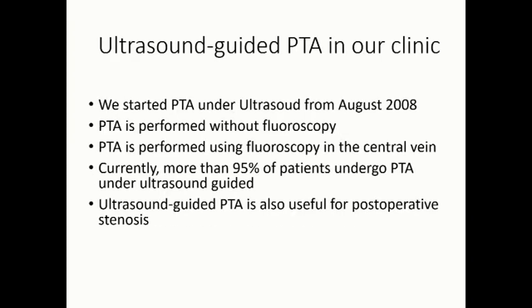Ultrasound-guided PTA in a clinic. We started PTA under ultrasound from August 2008. PTA is performed without fluoroscopy. PTA is performed using fluoroscopy in the central vein. Currently, more than 95% of the patients undergo ultrasound-guided PTA. Ultrasound-guided PTA is also useful for the postoperative.